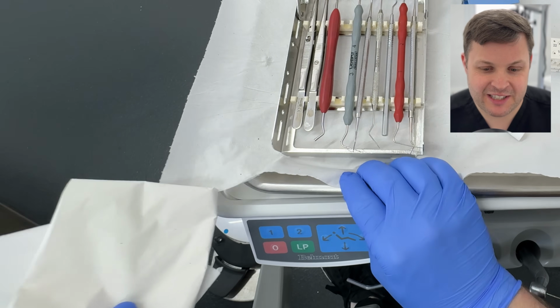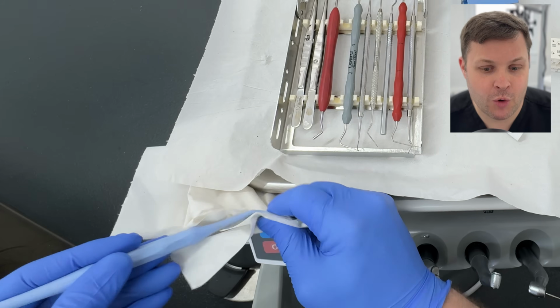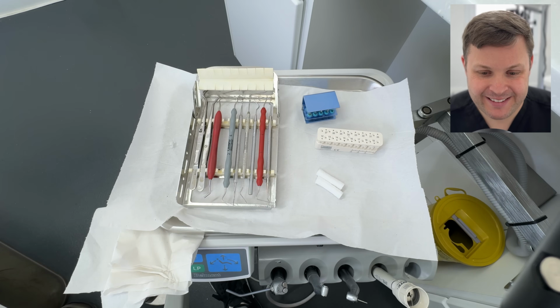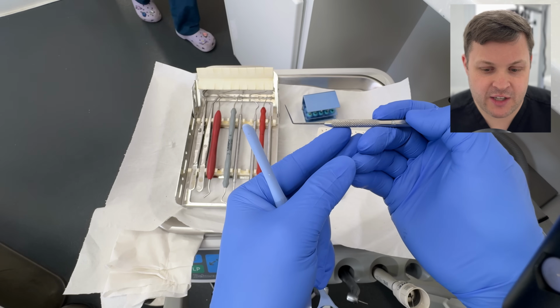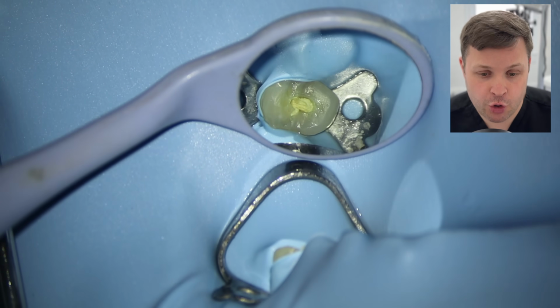And sometimes when I'm removing temporary filling materials, the water gets on my mirror, so I always like to have a little bit of paper roll on the corner there, so I can give my mirror a little wipe. But I'm going to use a DG16 endodontic probe to remove this dressing. This dressing was actually placed by her normal dentist.